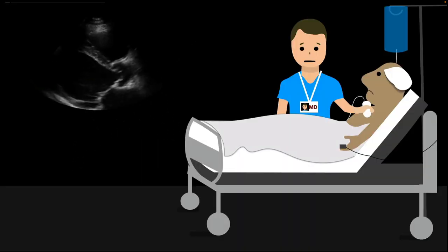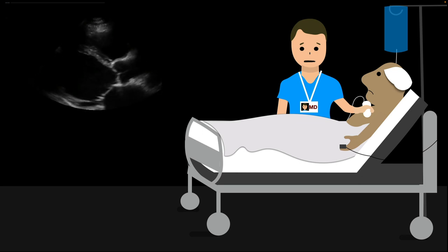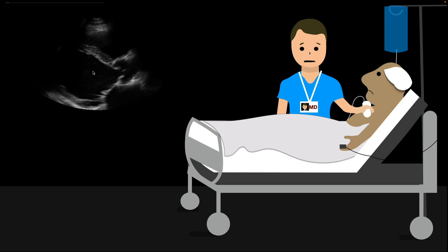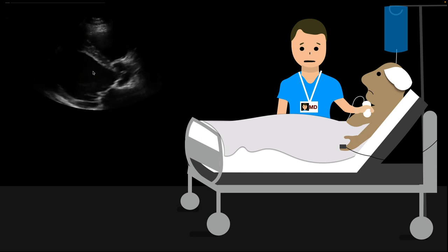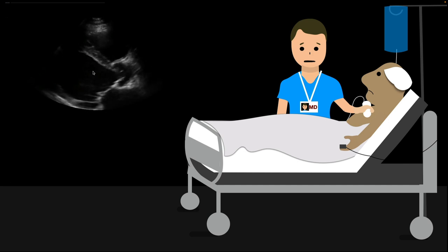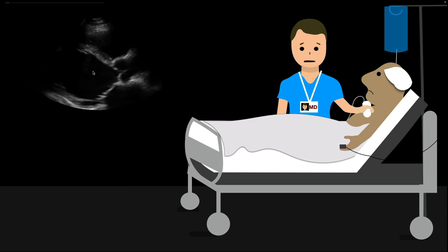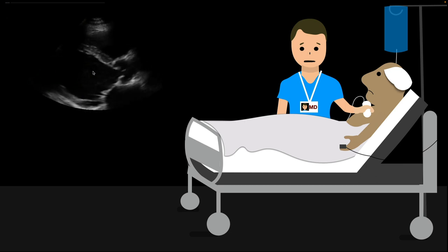Let's look at another example. We throw the ultrasound probe on the heart and it looks like this — another parasternal long view. You can see the left ventricle is just engorged, full of blood, and that's pushing on the walls of the ventricle, increasing resistance to coronary perfusion. I like to give this example: a patient comes in with chest pain and a blood pressure of 70 over 40. Are you okay with hooking up an IV and giving 250 mLs of crystalloids?